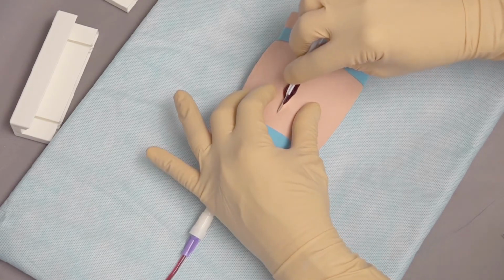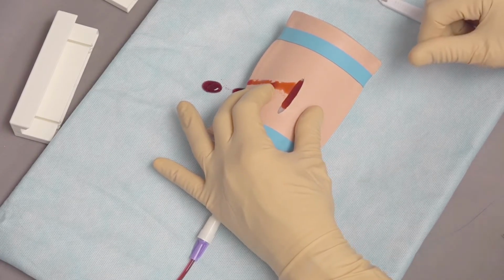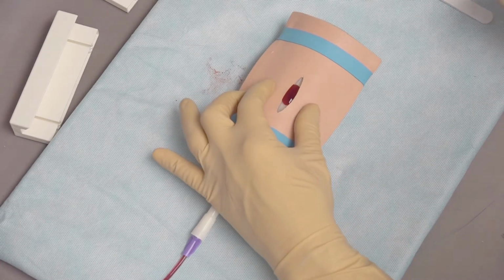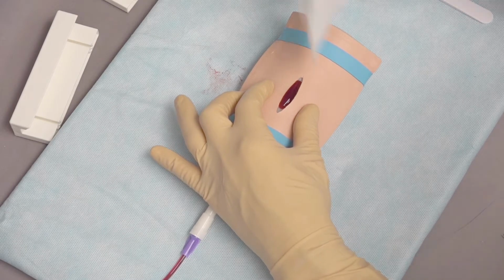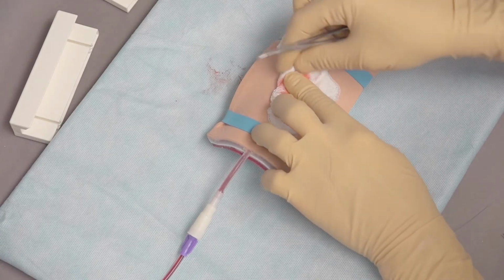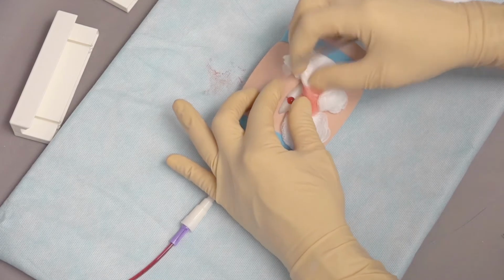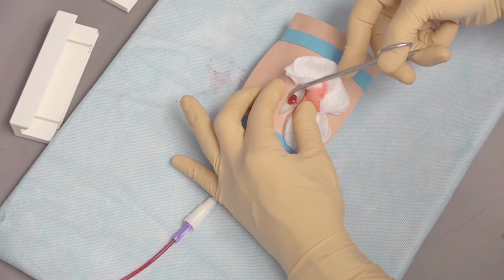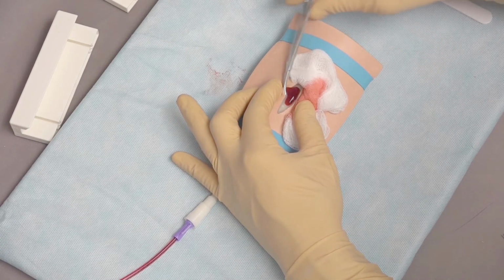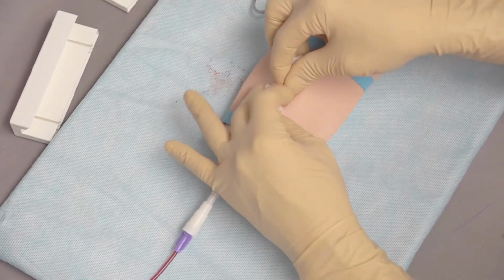So the key to doing this is to identify where the bleeders are coming from, and then we're going to identify where the vessels are. So you can see that we have bleeding coming up in this area. We're going to come in with our gauze and put some pressure on that because we need to identify where the vessels are. Work with the hemostat and slowly pull back on the hemostat and the gauze till we can see right where the vessel is. And there's the vessel right there. We've got a nice grasp of it. And ideally, we're going to get just the vessel, so we don't want to get any other subcutaneous tissues.